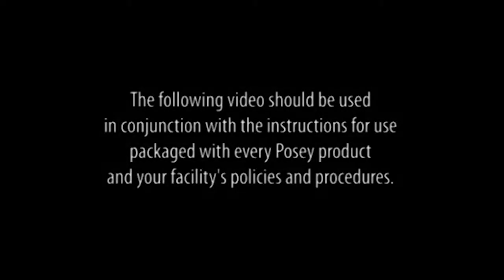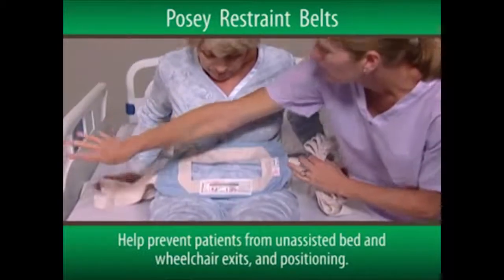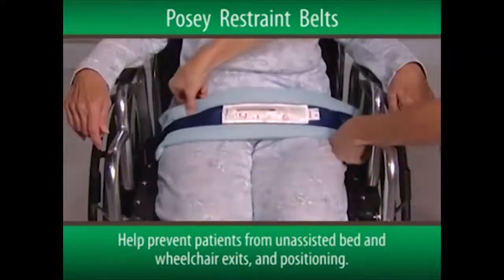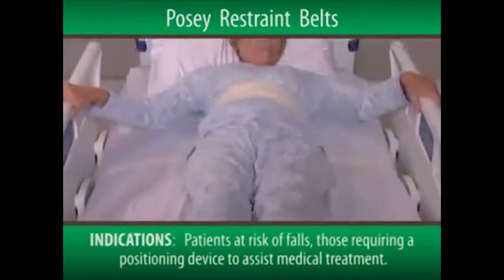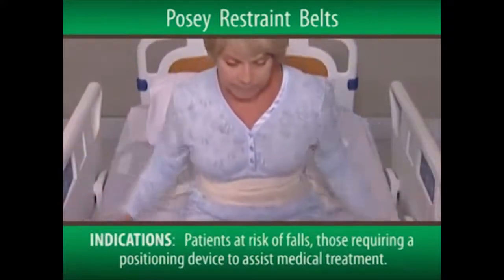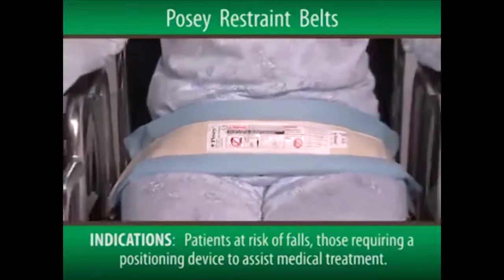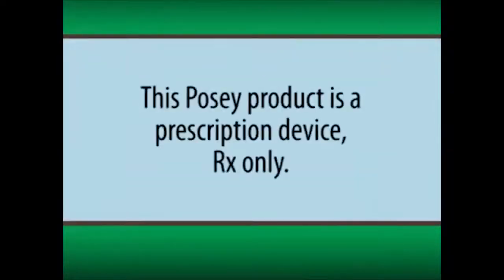The following video should be used in conjunction with the instructions for use packaged with every Posey product and your facility's policies and procedures. The Posey Restraint Belts are used to help prevent patients from unassisted bed and wheelchair exits and positioning. They're indicated for patients assessed to be at risk of injury from a fall, or those requiring a positioning device to assist medical treatment. It's important to note that this Posey product is a prescription device, RX only.